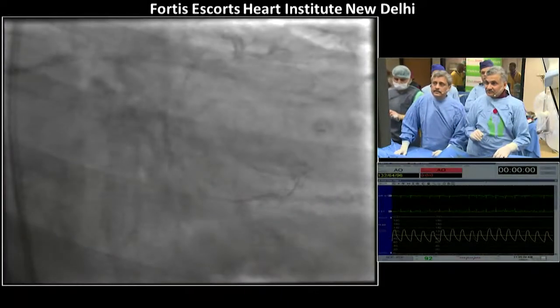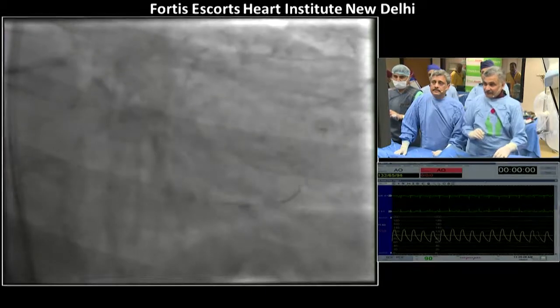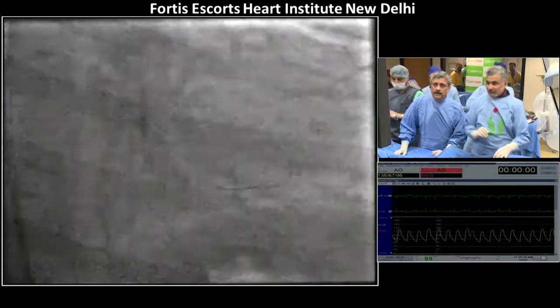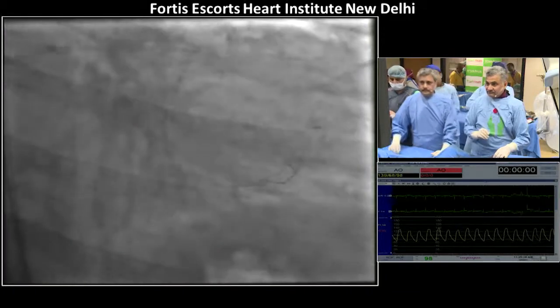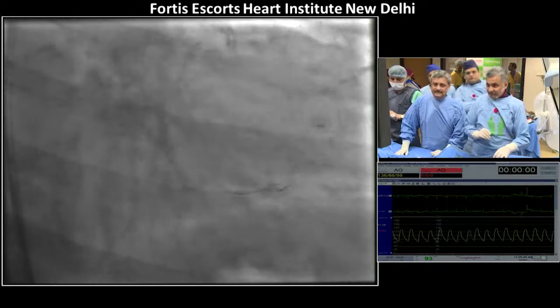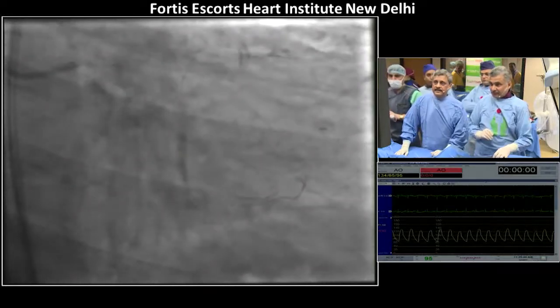7, 8, 9, 10, 11, 12, 13, 14. You won't know it because she's already had her infarct. So distal 14, and there's a fibrotic area over there. Is she having any pain? That's the most important thing I want to ask. Right now she's been sedated because she was having a lot of discomfort while lying on the table.